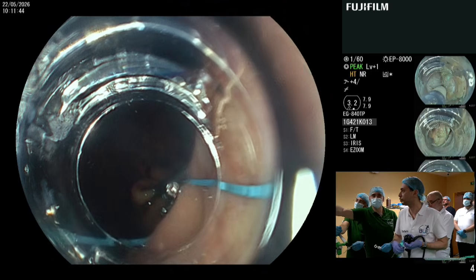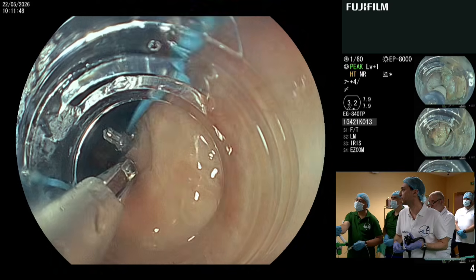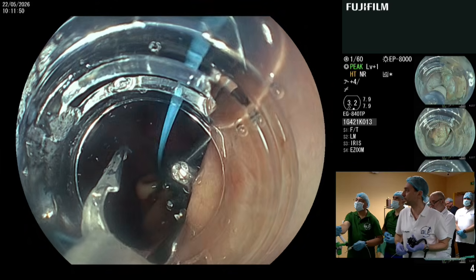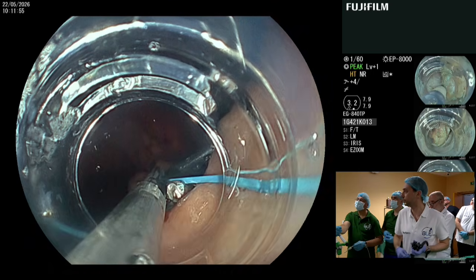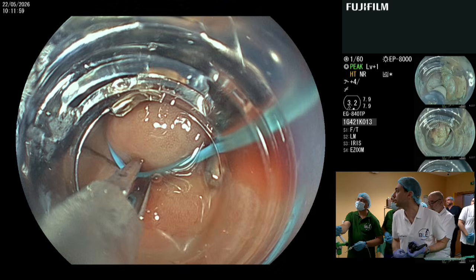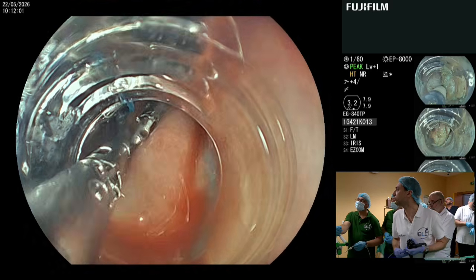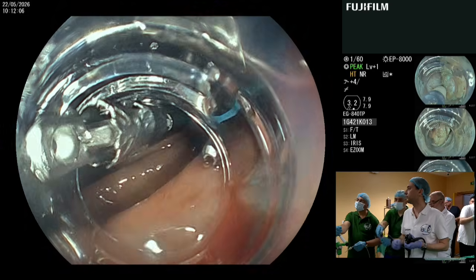The left side needs to be there, yes. You have to attach the left side. Open a little bit, just to grasp the... All right, close, all right, good. Now we have to go here, in front of the lesion. Here, open, close. It's done, okay, fire. Yes, yes, yes, very good.